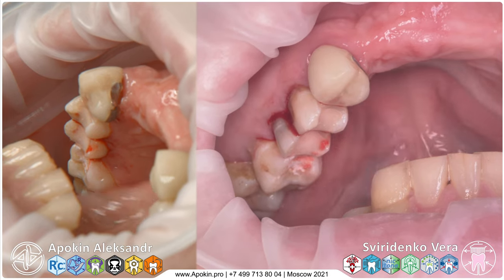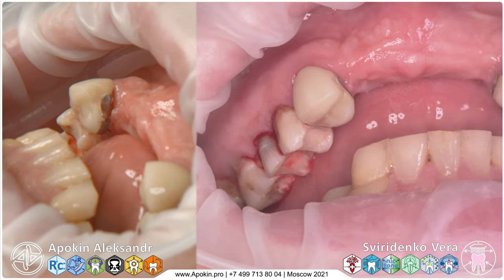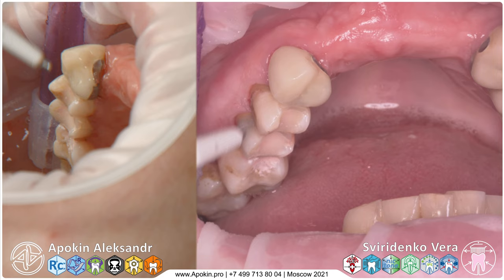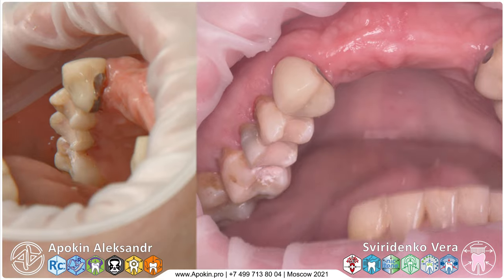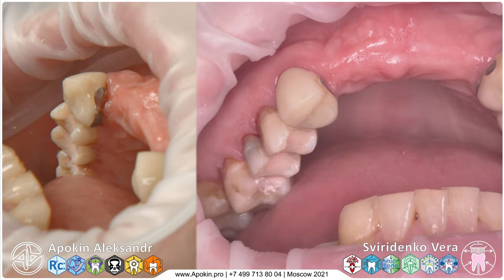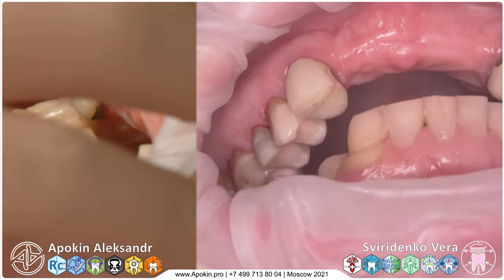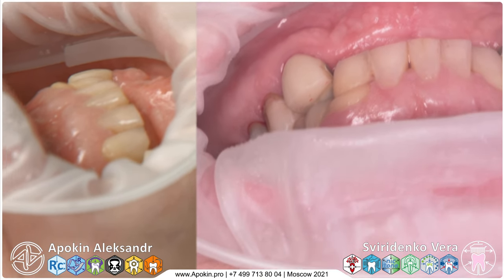We have some blood in the interdental space. This is not dangerous because we have a problem with periodontal, periodontal with this old restoration with this caries. But I think during next week we have no problem. I hope we see it on recall. Next we check occlusal. Show me, please, you can look. Ah, good. No need for correction. And on this point we stop.